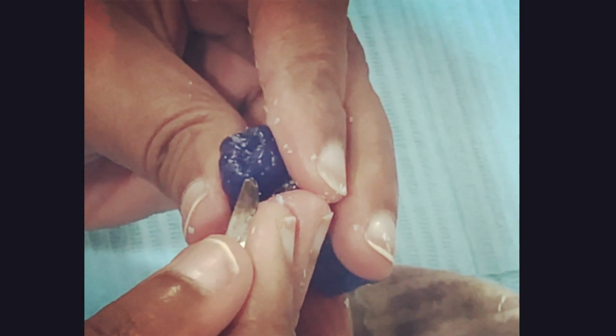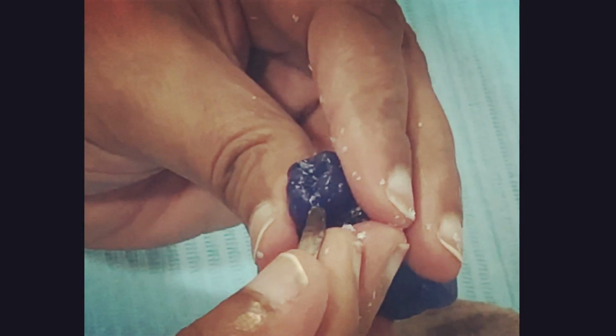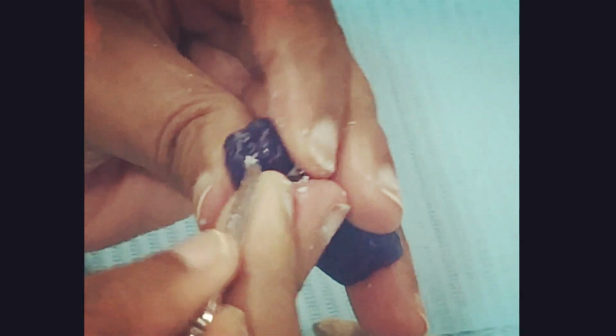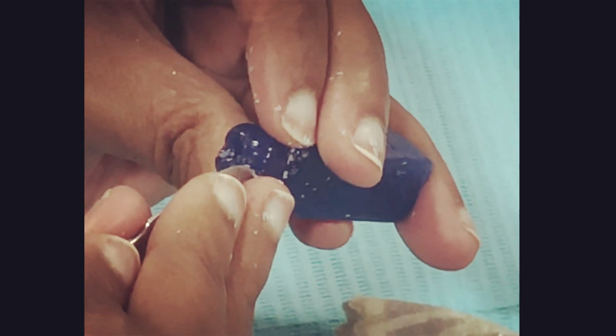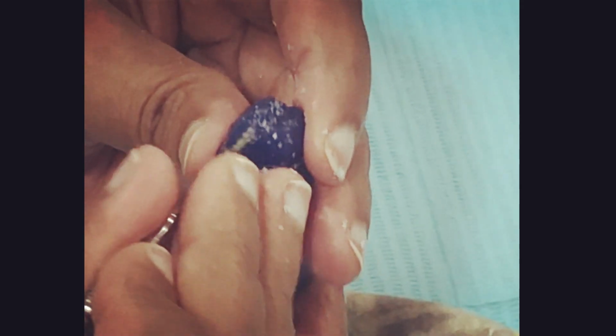Same on the other side. So once you've created the fossa, again carve around it, okay, and make it smooth.